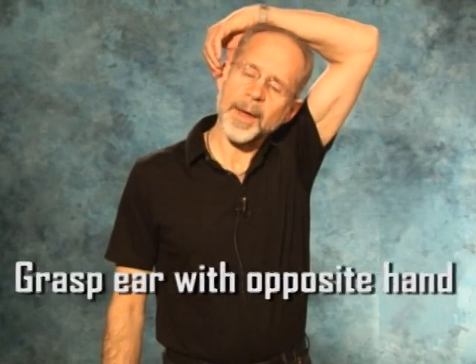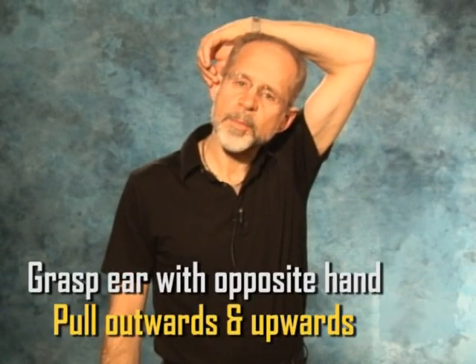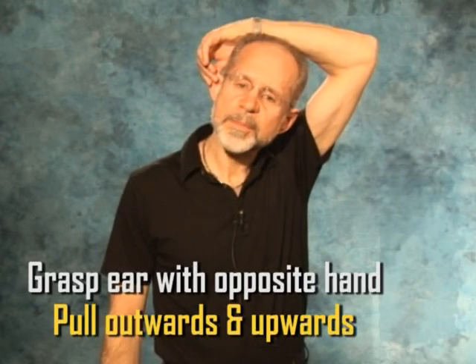Proper insertion of an earplug may seem obvious. Just stick it in your ear. However, for many of us, bends and shape changes in the ear canal make it difficult to fit the plug well. So the key when you're first learning how to use an earplug or another style of earplug is to first reach over your head with the hand opposite the ear that is being fitted and grasp the ear firmly and pull it upwards and outwards.